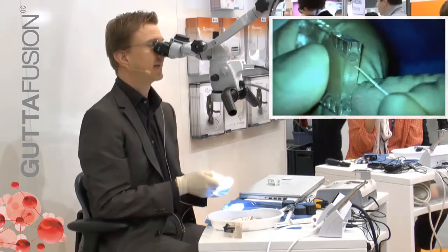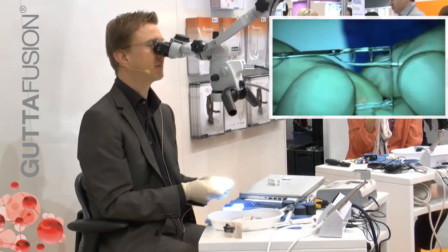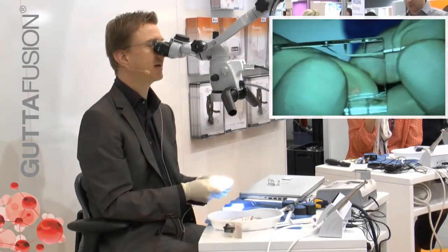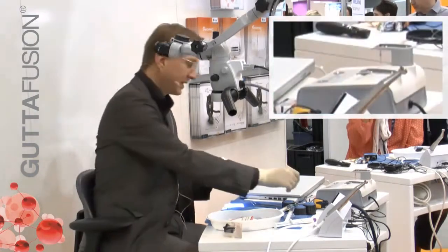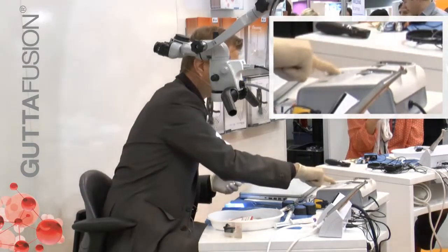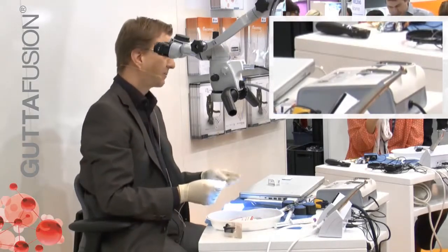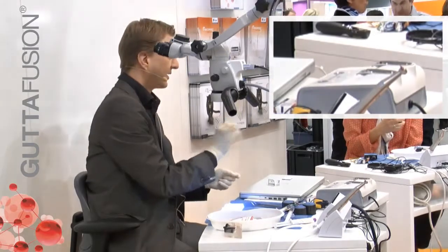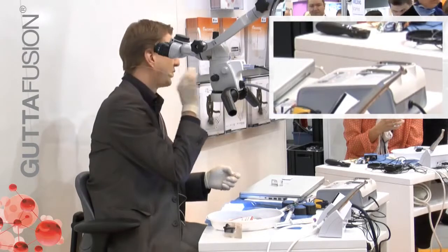So let's say I'm obturating this. I insert the paper point and place the sealer in the root canal, and you can see it's a thin layer of sealer. We need mostly gutta-percha, only very, very little sealer. I now heat the obturator, and it takes a minute, and then don't be afraid that it will cool off on you too quickly. We have all the time.